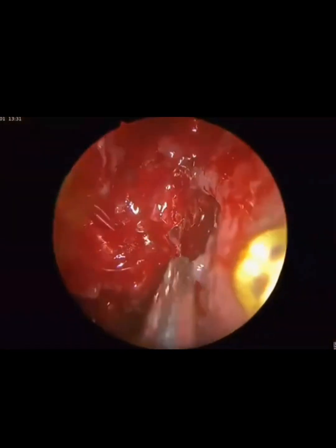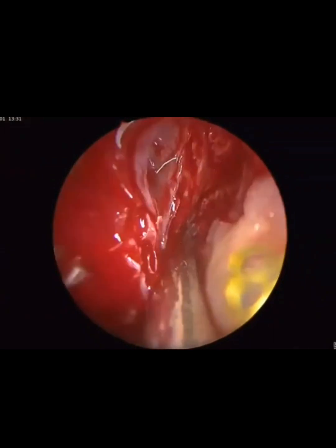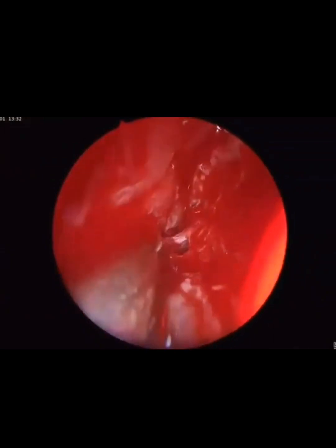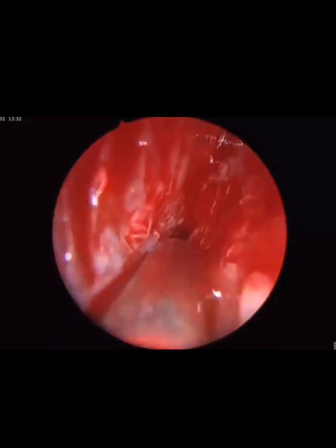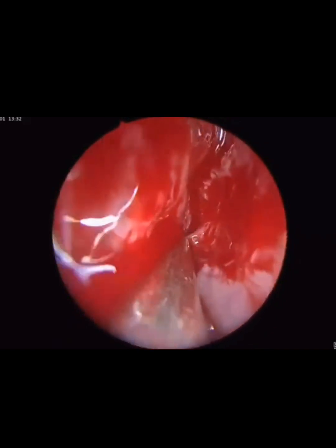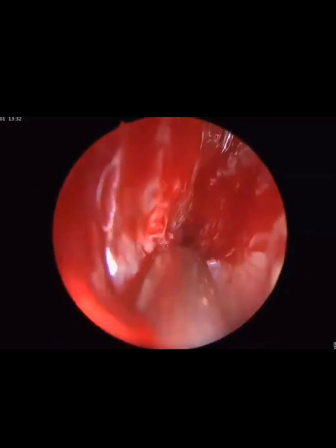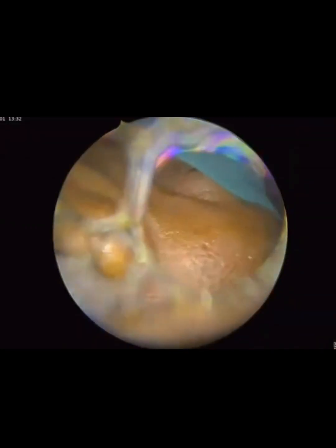Merocel. I think this is the sphenoid. Okay. See, an air bubble is coming out. Yes, this is a very important sign for juniors. Whenever air bubbles come, the sinus is open. Okay. Bleeding is there. I have to keep Merocel there. Small Merocel, please.